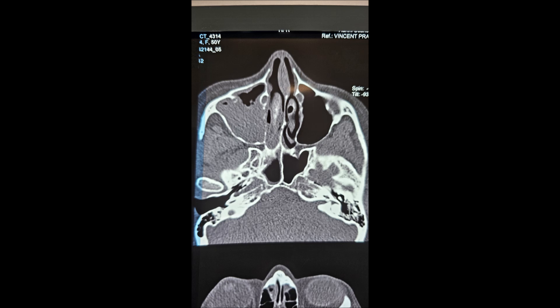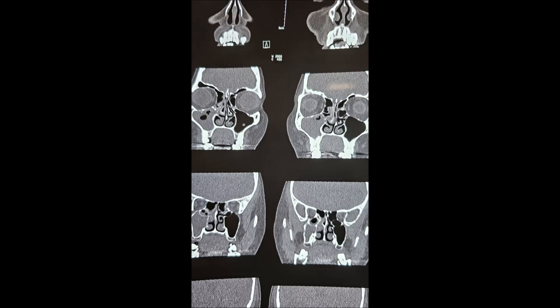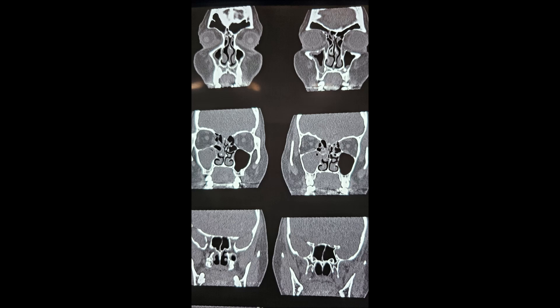You can see the axial CT picture showing the right maxillary sinusitis. It is a chronic sinusitis and a concha bullosa. This is a coronal picture showing the right chronic maxillary sinusitis with a concha bullosa on the right side. There is also a subtle spur to the left side which is insignificant.